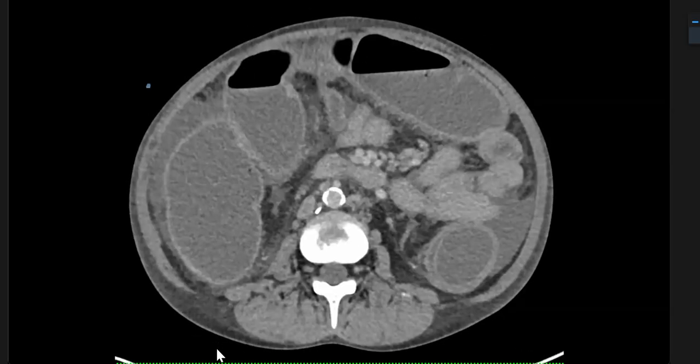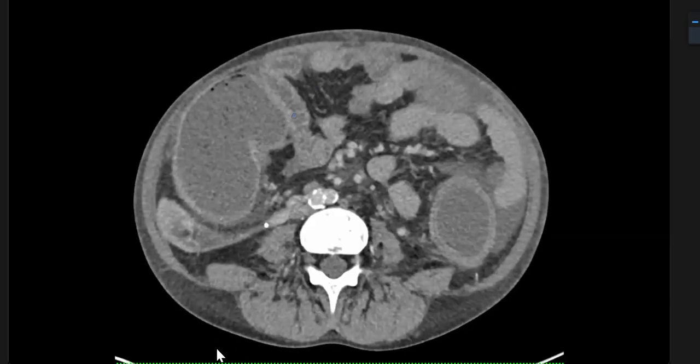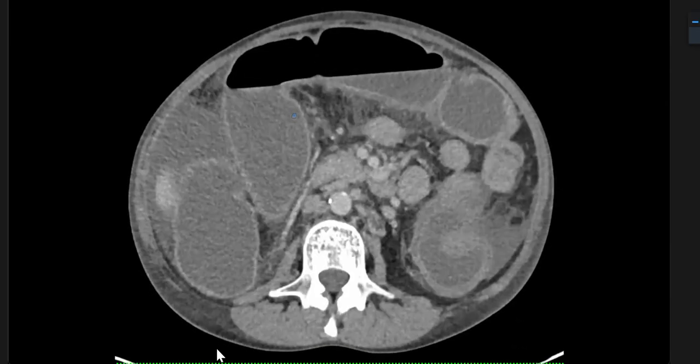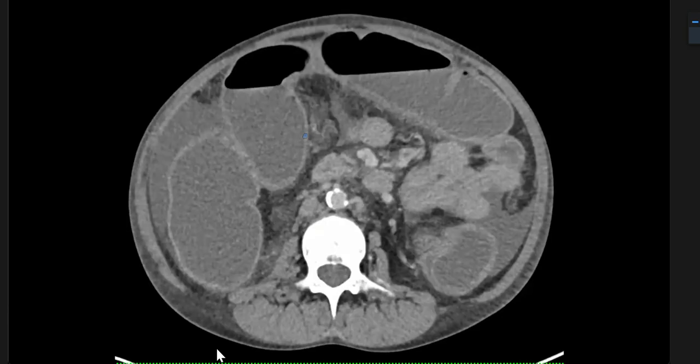It's good to talk about kidneys, bulging kidney, absent kidney, spine, portal hypertension, varices, but I was switched off when you were saying those. I'll be honest, I was not interested. You got my attention when you said intussusception. Then I was switched off again when you were saying the transition point on the right side. This is a complete pancolitis. If this cannot be appreciated as pancolitis, then what kind of inflammation do you want? The complete loss of haustration.